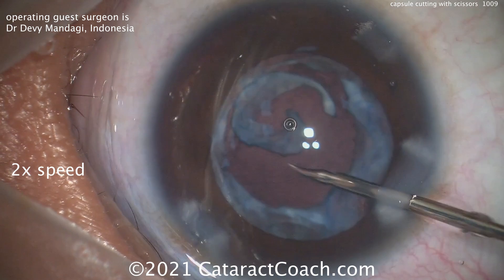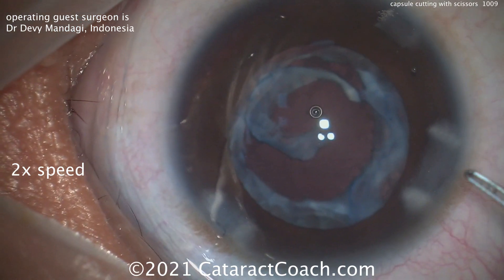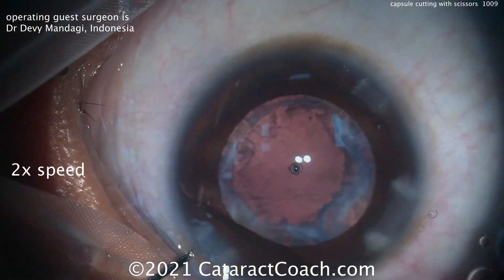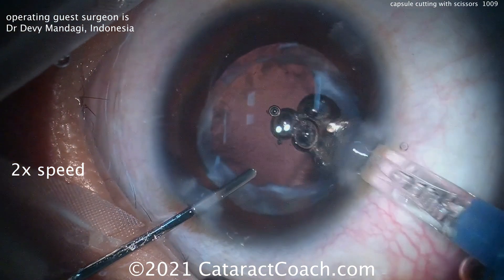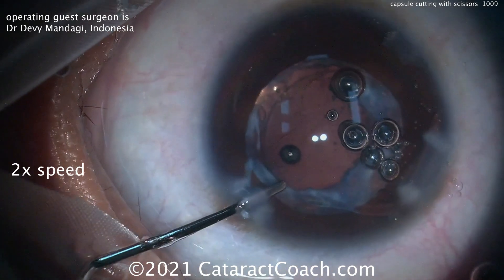There we go — got a nice crescent of that scar tissue off, and we can pull that outside the eye. That's totally free. Now here comes the lens. The IOL is going to go in the capsular bag — a single-piece acrylic lens. That'll go in quite nicely, and that's a good choice for this eye.